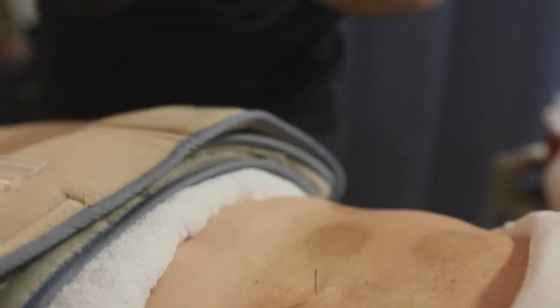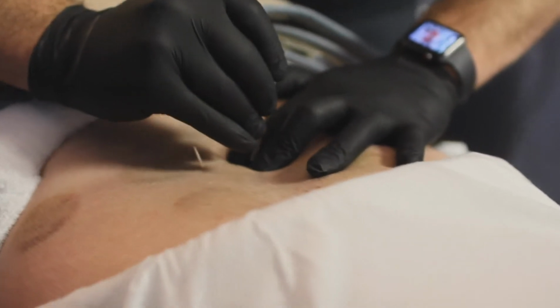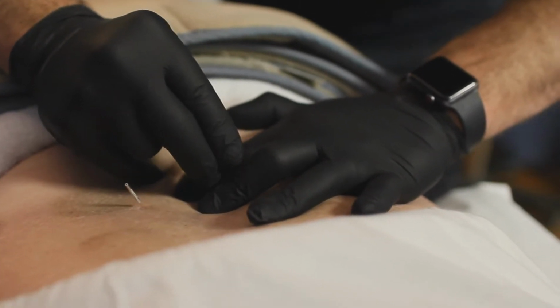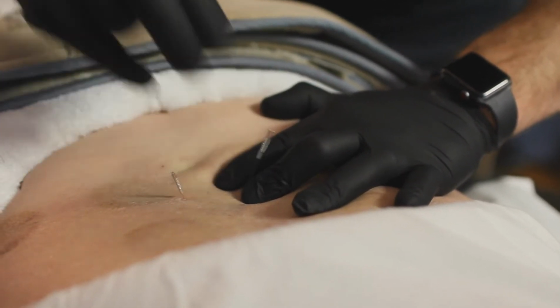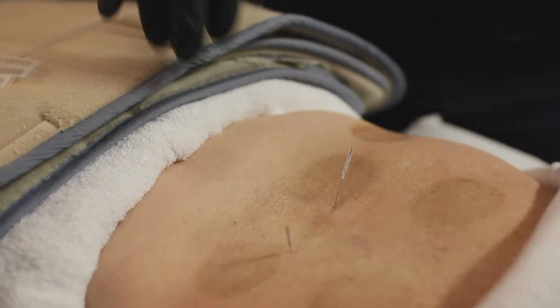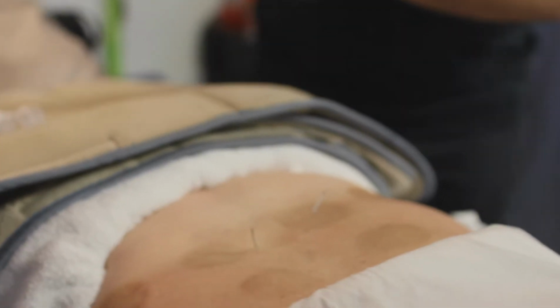and then we're going to do the same thing on the other side. We'll insert the needle directly into the muscle there. Alright, so that would be your L3 spinal segment. And then we're going to go between L4 and L5 here.